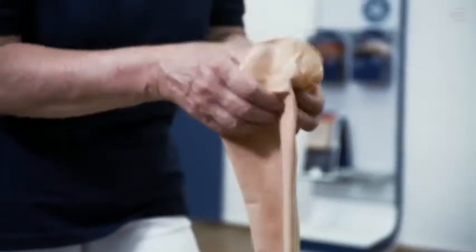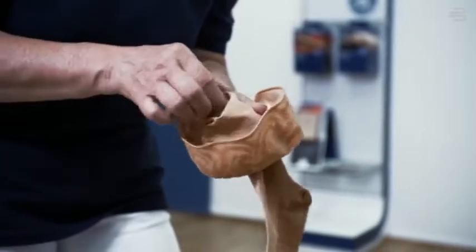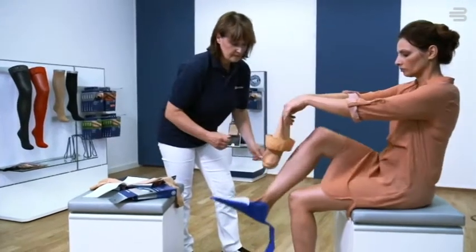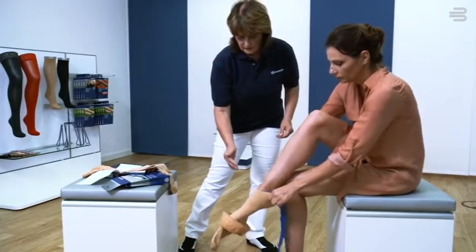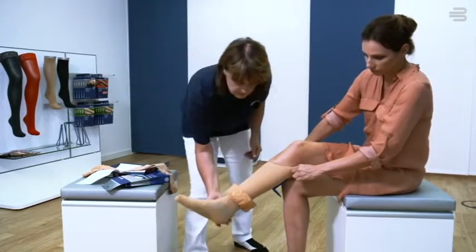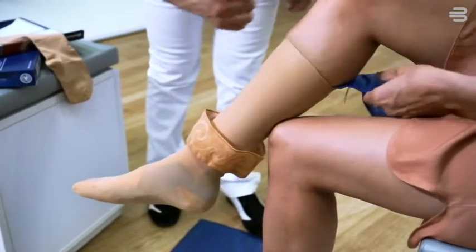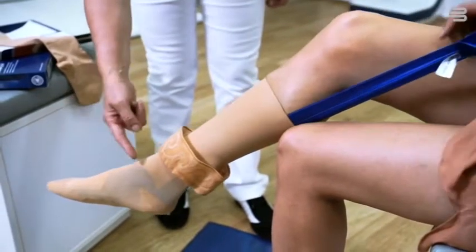Unfold the compression stocking a good half of the way without creating any creases at the edges. With the glider, push steadily into the foot of the stocking. Now use the loop provided to pull the glider out slowly and completely.